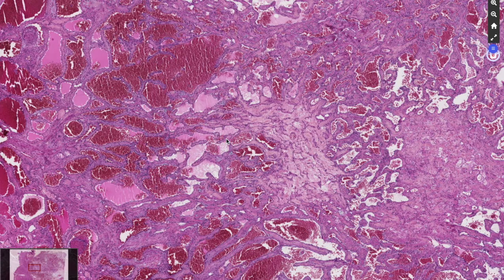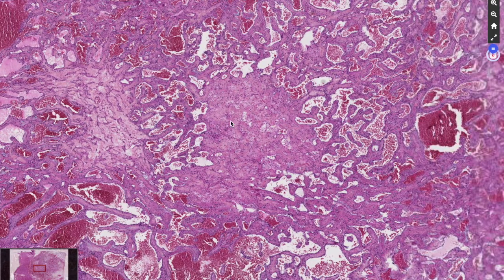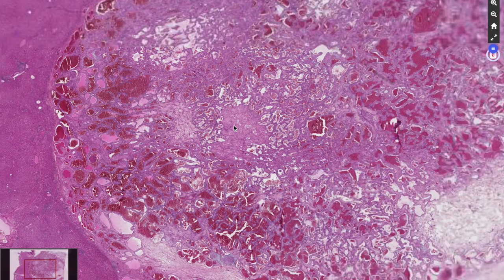So when you have a biopsy with fibrosis and also some vessels, always think maybe it can be a sclerosed hemangioma, and these fibrotic areas are responsible for this atypical pattern at imaging. So that was really a textbook hemangioma of the liver. It's benign, it's really frequent in the general population, and radiologists see them really often, but we don't, because there is no need for a biopsy most often and no need for surgical resection.